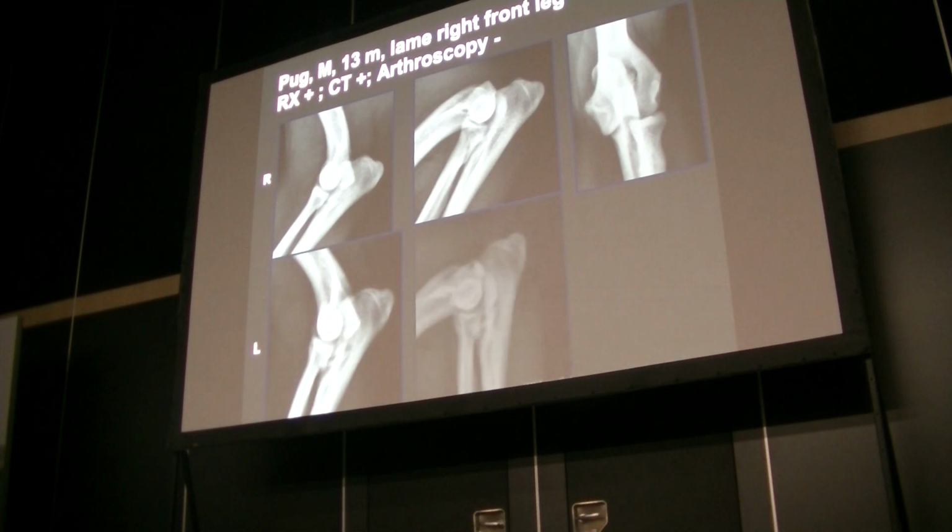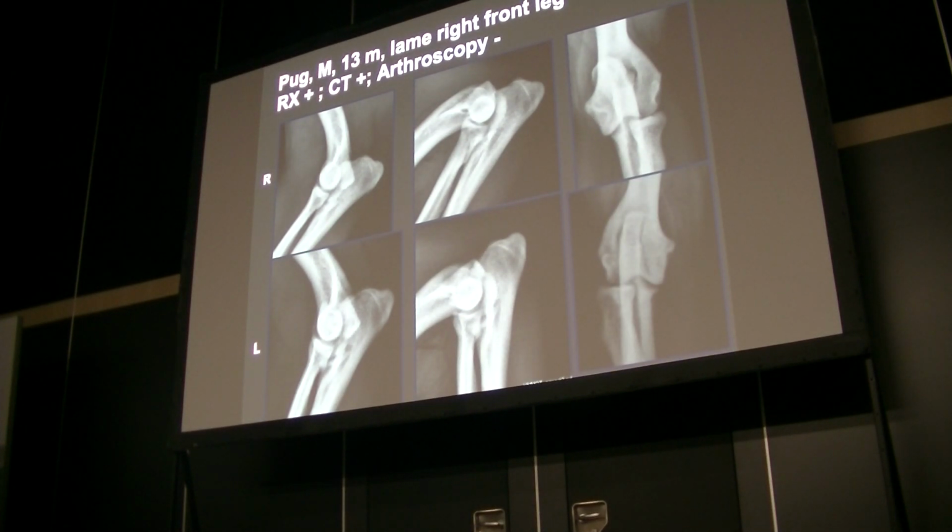These are the sets of x-rays, the right and the left elbow. And if we look at the coronoid process and try to follow it, if we look at this area for sclerosis, also on this radiograph, and on the left the same, it's an irregular delineation, inhomogeneous density, and here for sure the coronoid process is very poorly delineated, and there is brightness here, sclerosis.